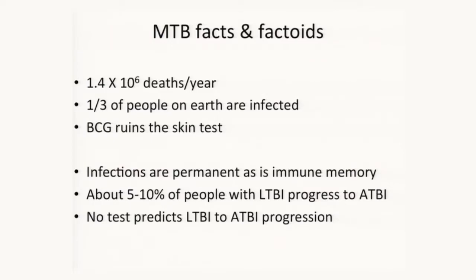I used the word ruins there, but because the bacteria are so cross-reactive, BCG is a live bacterial vaccine, leads to immunity, and that immunity cross-reacts with that PPD stuff that you get that little bubble under the skin. There's a lot of cross-reactivity, making it difficult to interpret a positive skin test in somebody who's had BCG. So one take-home from today is that the IGRA tests, the ones I'm going to talk about today, are not affected by BCG vaccination. So you can see a potential advantage there.